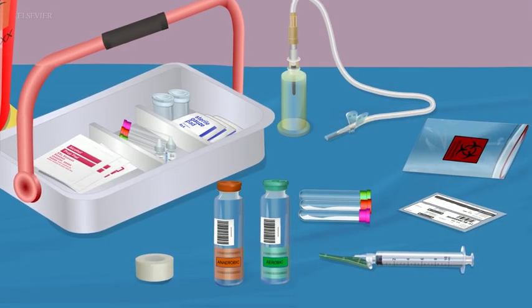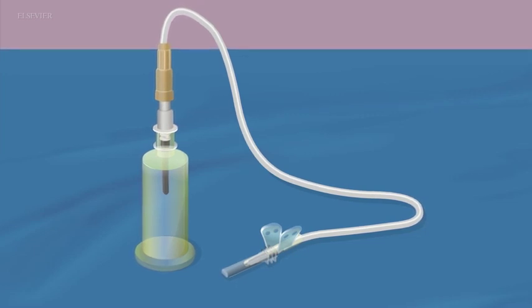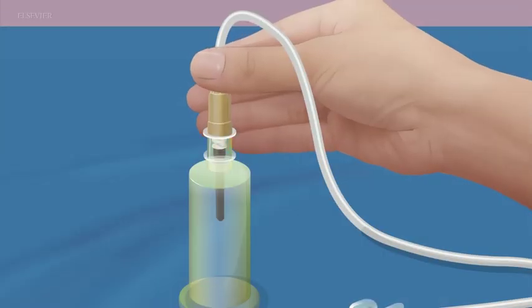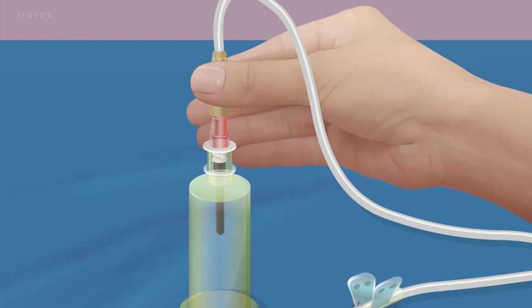Prepare the collection equipment. Ensure that a winged butterfly venipuncture needle with tubing and a safety device is securely attached to the vacuum extraction system collection barrel. Alternatively, and if required, remove the sterile cap from the rubber-sheathed end of the winged butterfly needle tubing and make the luer lock connection of the sheathed needle and the collection barrel. If a single-ended winged butterfly needle with tubing is used, make the luer lock connection between the needle and the collection barrel housing of a sheathed needle. Keep the needle hub and the connection sites sterile.